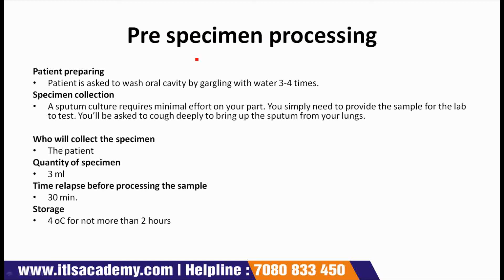Pre-specimen processing. First one is patient preparation. Patient is asked to wash oral cavity by gargling with water 3 to 4 times. This is patient preparation.